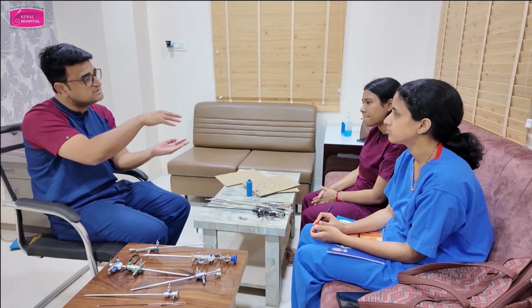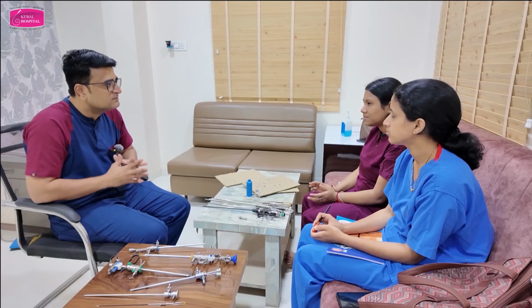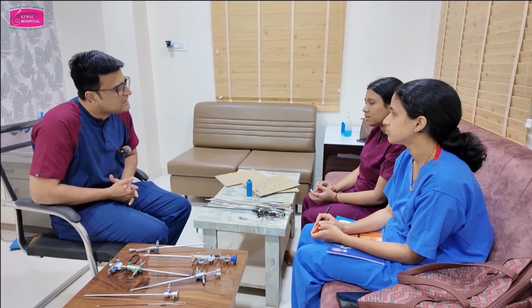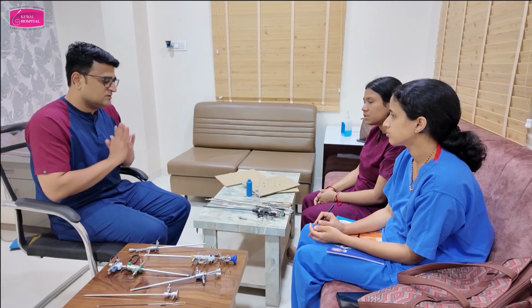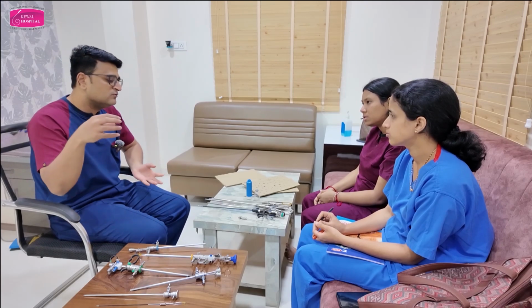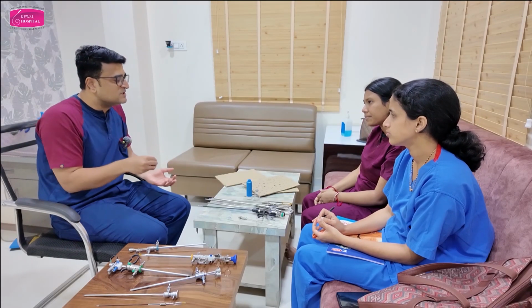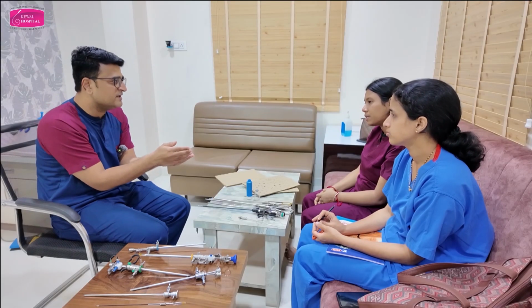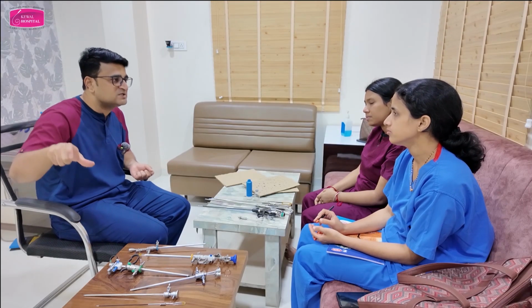If the uterine cavity is distended, then you don't ask your assistant to increase the pressure. Clear? No confusion? You can ask me everything. Machine pressure and inside pressure. See, now understand one thing. The machine is used to give you normal saline with some flow rate. That normal saline is going inside the uterine cavity and increasing the pressure. Understood? So you have to set the pressure on the machine, like you set the pressure on the CO2 insufflator.